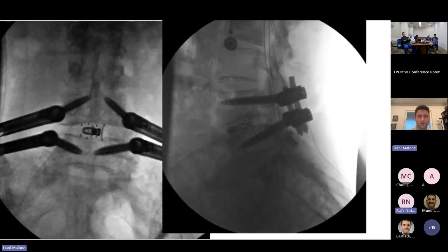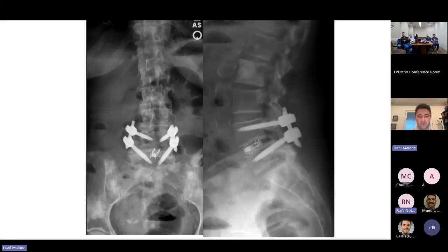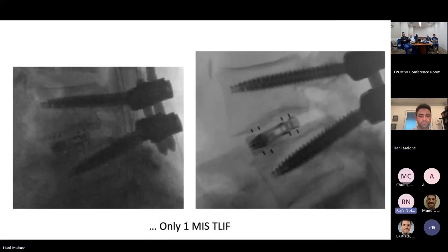When I was maybe working by myself and the TLIF option wasn't appropriate, or the simultaneous 2 TLIF option wasn't something I could do efficiently, you could certainly still just do 1. This is another instance of that adaptive geometry cage, and she ultimately did really well. So it can work. Obviously not excellent lordosis, but some improvement there, and at a minimum, in this 83-year-old woman, solved her cauda equina issue.